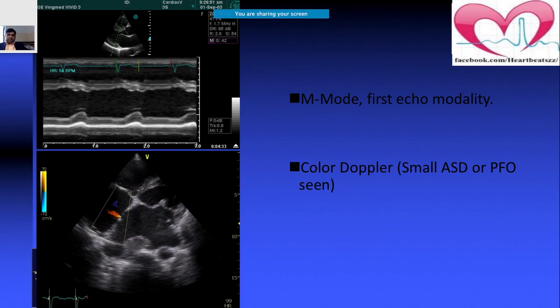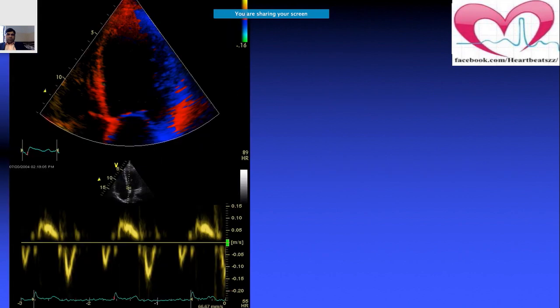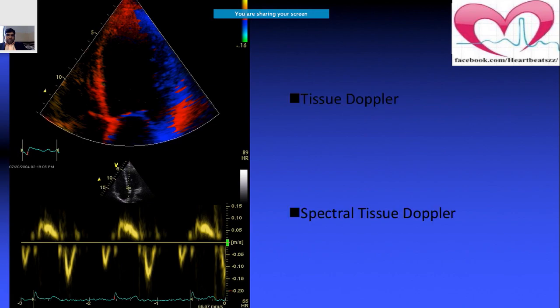With color Doppler added, you can identify what could be a small ASD or even a patent foramen ovale (PFO). The next image shows tissue Doppler imaging.